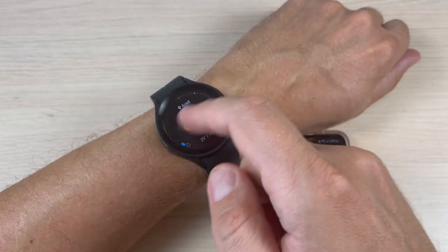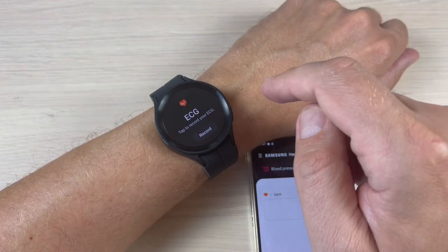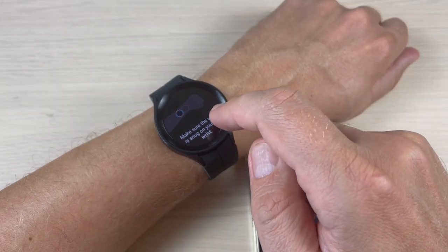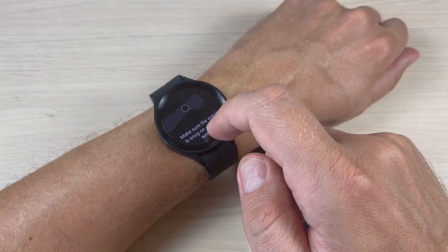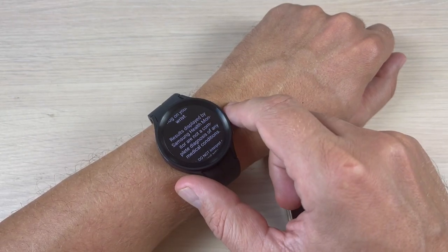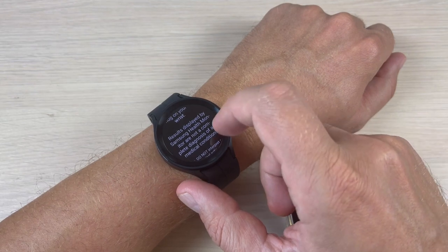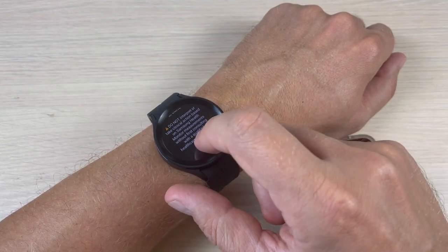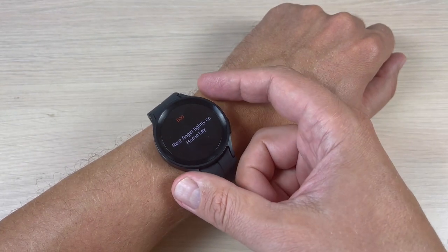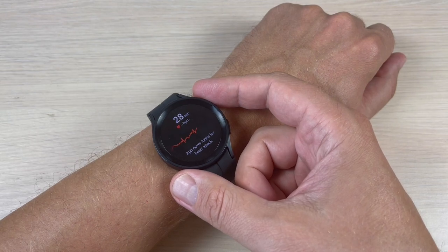I will go back to ECG measure. Now press 'Record'. Make sure the watch is snug on your left wrist. You should know that the results displayed by Samsung Health Monitor are not a complete diagnosis of any medical condition. Now press 'Okay' and rest your finger lightly on the home key. Now you need to wait for 30 seconds.